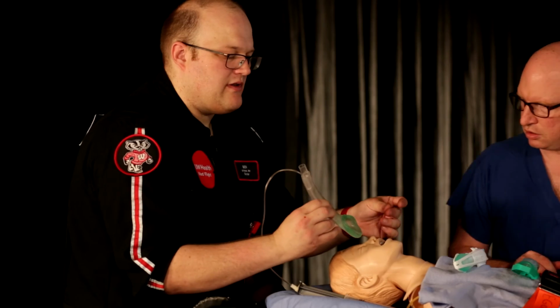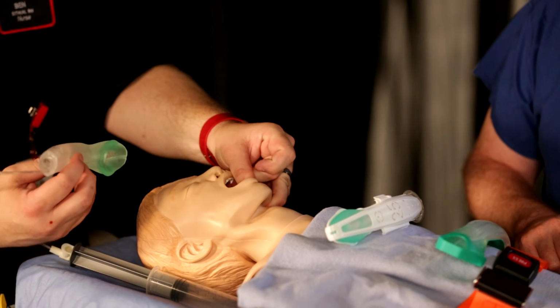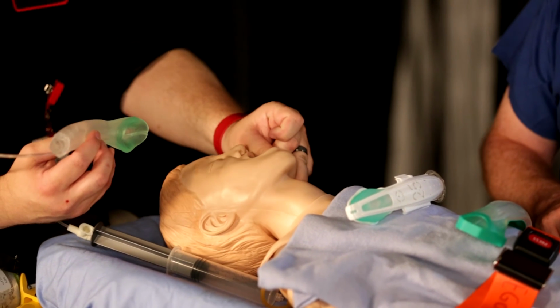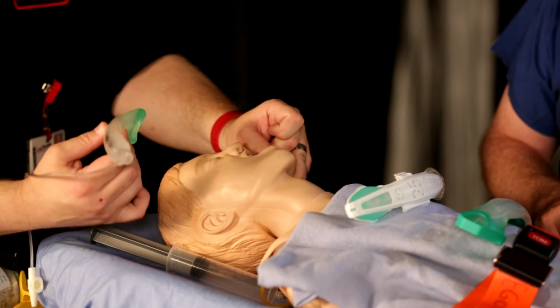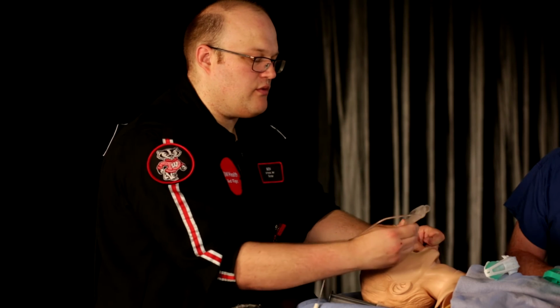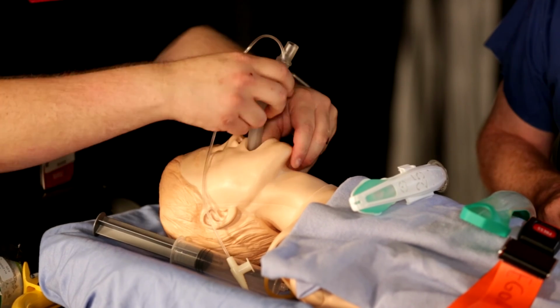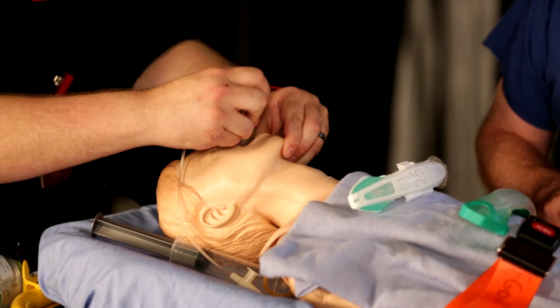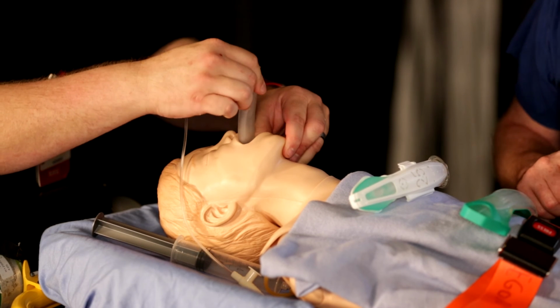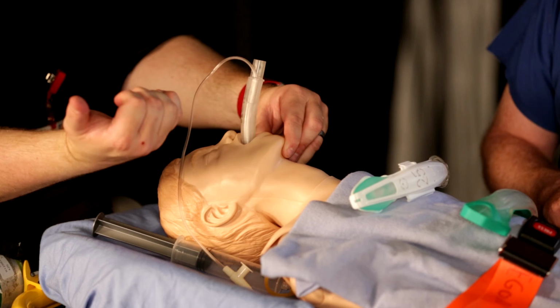And then what I'm going to do is I'm going to do the same thing. I'm going to use my scissor technique. I'm going to open the airway, and I also try and grab the tongue so that I don't push the tongue back, because that's one of the things that people fail with, is if you drive the tongue in the back of the oropharynx, it's going to obstruct the view. So what I'm going to do is just get past the tongue and push. It feels like a lot more force than maybe you're used to, but you're not going to do damage. The worst thing that's going to happen is it's going to flip up on itself.